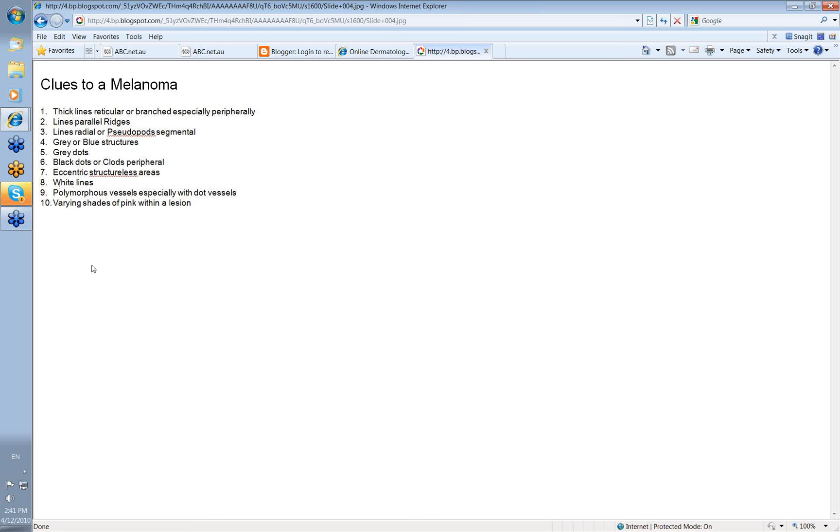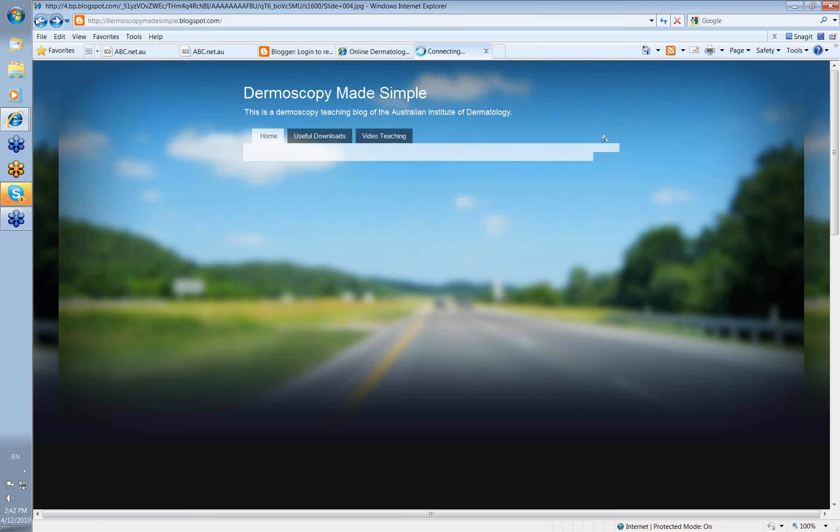We'll go into what these are later, but they're bits of collagen normally, deeper in the dermis. Polymorphous vessels, especially with dot vessels. And you'll see what I mean by these when you come to the vessel section. And if a lesion has varying shades of pink within it, then that may be the only presentation of hypomelanotic or an amelanotic melanoma. We'll show you examples of all of these clues later.